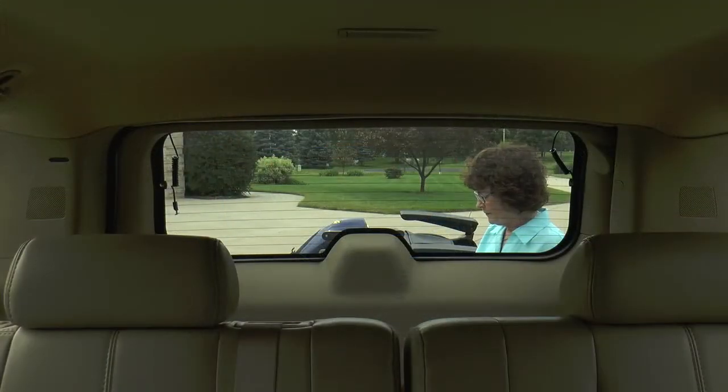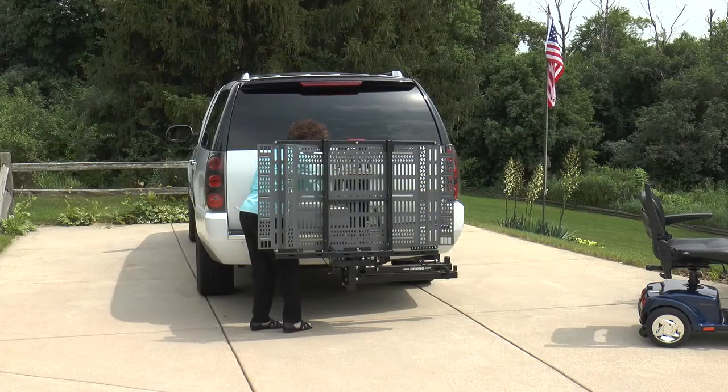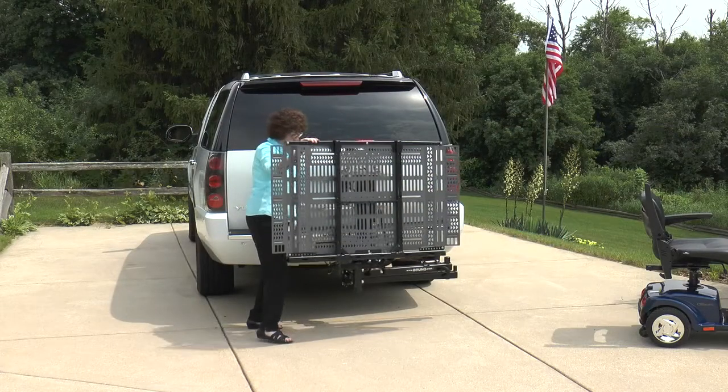Traveling with your mobility device is easier than ever with the Outsider. Its low profile design allows visibility behind you, and Bruno's independent safety testing ensures peace of mind.